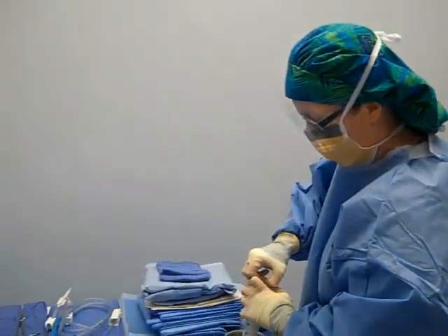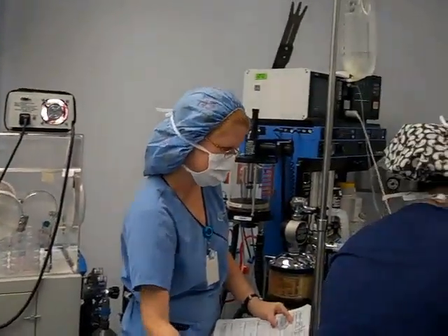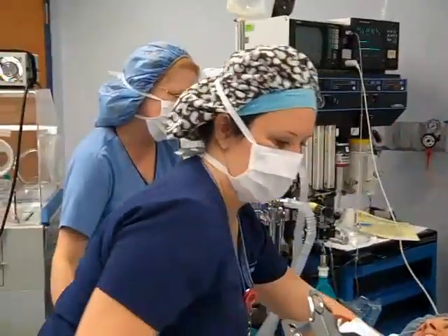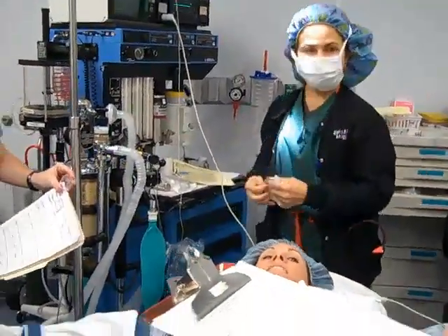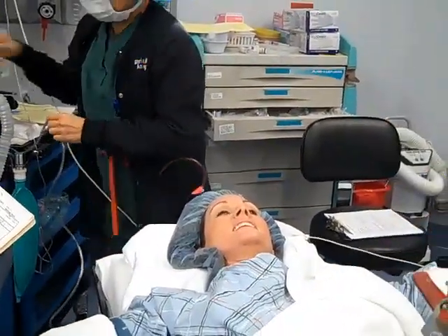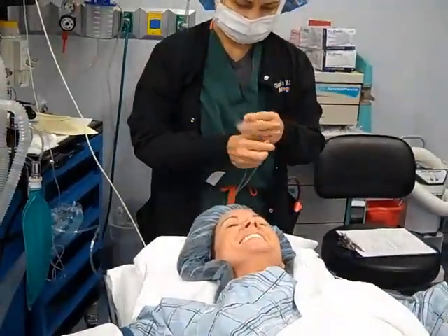Are you doing okay? Are you okay with your arm? Yes. Just let me know. Okay, guys, I'm Laura, I'm the embryologist. I'm going to be taking care of your eggs for you. Great, thank you. We're going to confirm that it's really you. This is Elizabeth Valdiga, date of birth 11-3-1974, here for an egg aspiration for Dr. Tarantino. That's her. Going to get some sweet sleeping stuff — have a good night.